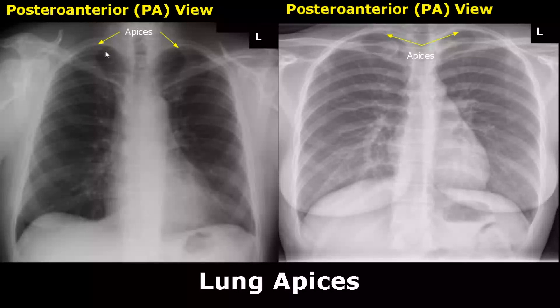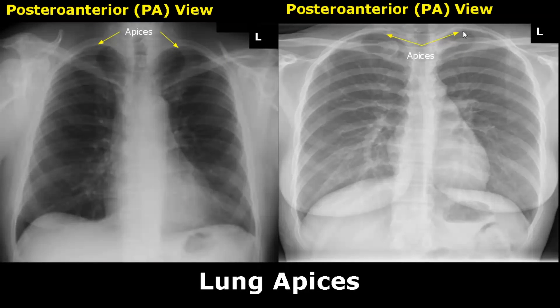The uppermost part of the lungs are the apices. The lung apex lies above the inferior margin of the clavicle, i.e., the collar bone. It is an important location and needs to be reviewed because some pathologies occur in this region.